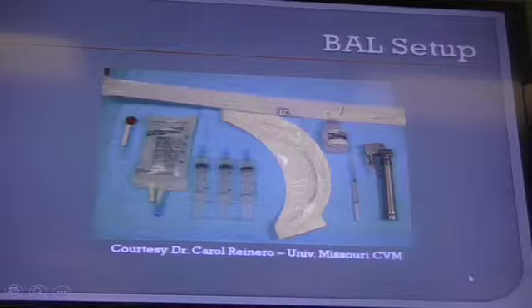In your articles that are posted, there should be something about doing a BAL. This is something that you can do in general practice if you're comfortable with it. It makes some people nervous because essentially you're drowning your patient in order to get a sample from their airway, but we do it in a controlled fashion. So we make sure our patient is intubated. We put them under general anesthesia or at least a heavy sedation.